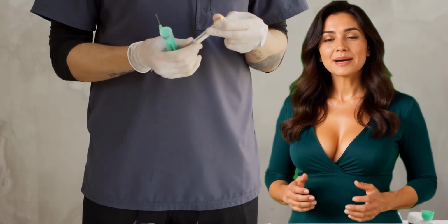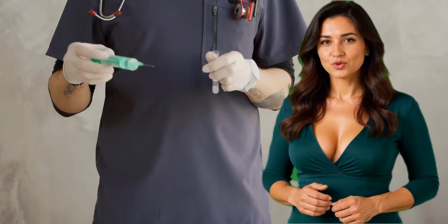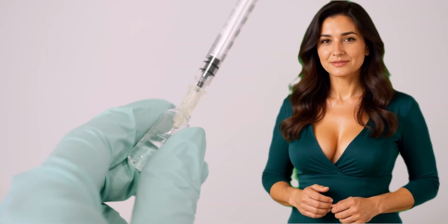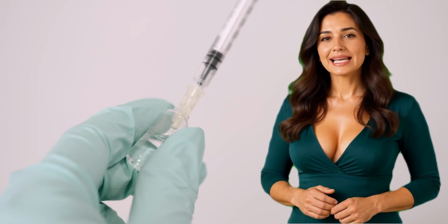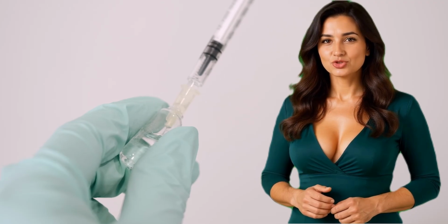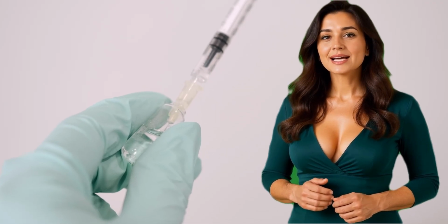Before administering the medication, clean the injection port with an antiseptic wipe. Allow it to dry completely. Administer the medication slowly and in a controlled manner. Injecting medication too quickly may cause unwanted side effects.